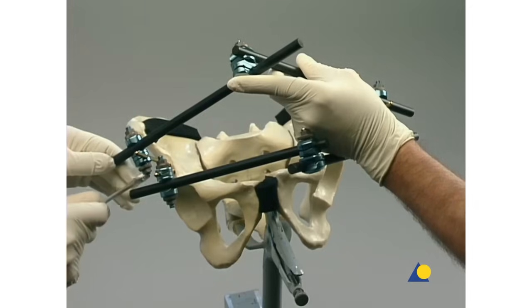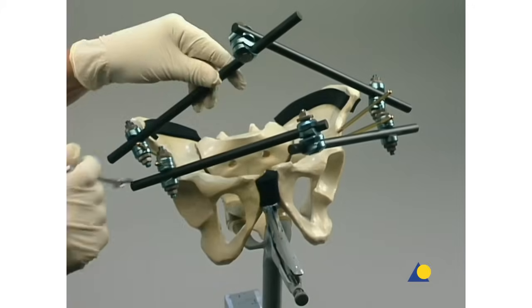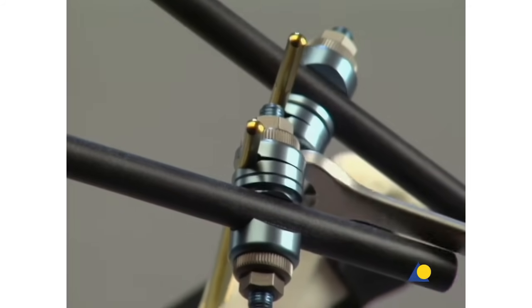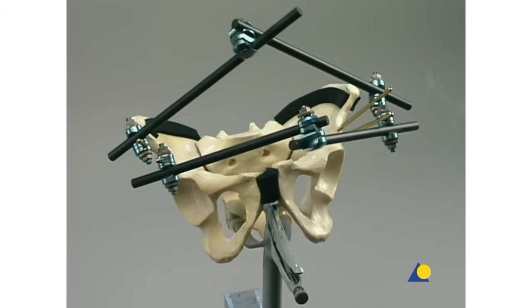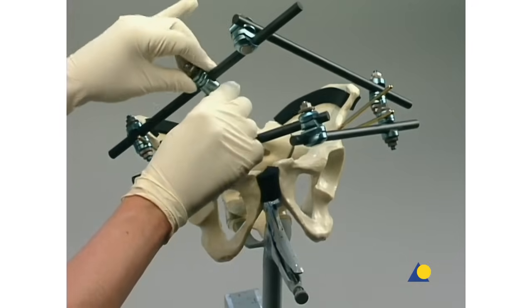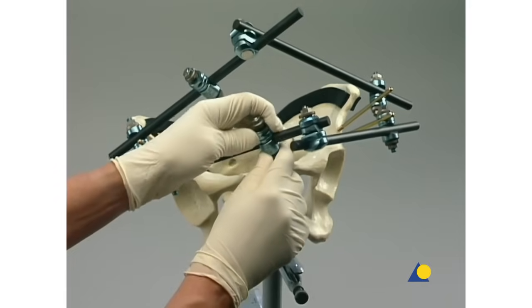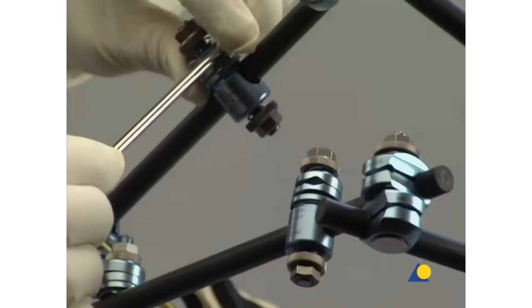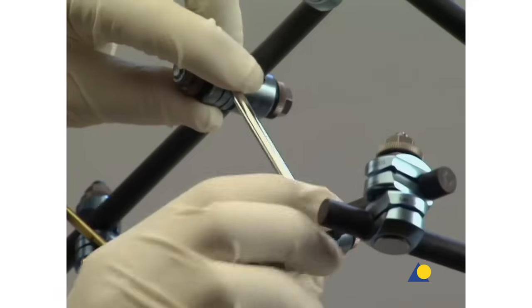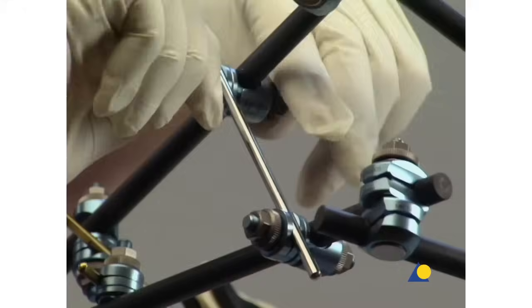Final tightening is completed with the combination wrench. An open adjustable clamp is attached to both the upper and lower carbon fiber rods. The 5-millimeter connecting rod is used to join the two clamps, bridging the upper and lower frames. The clamp nuts are tightened in the usual manner.